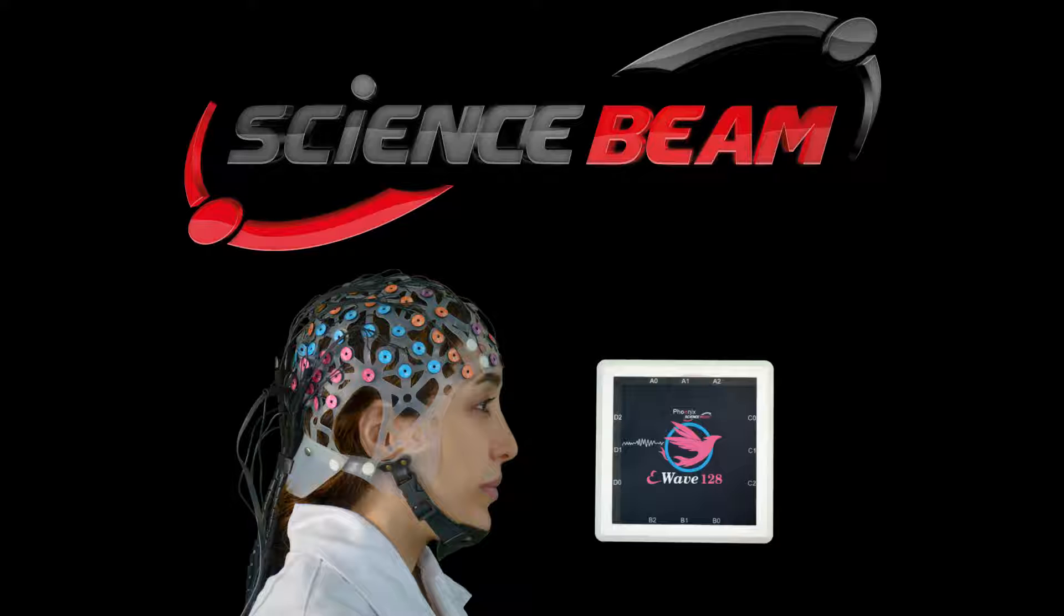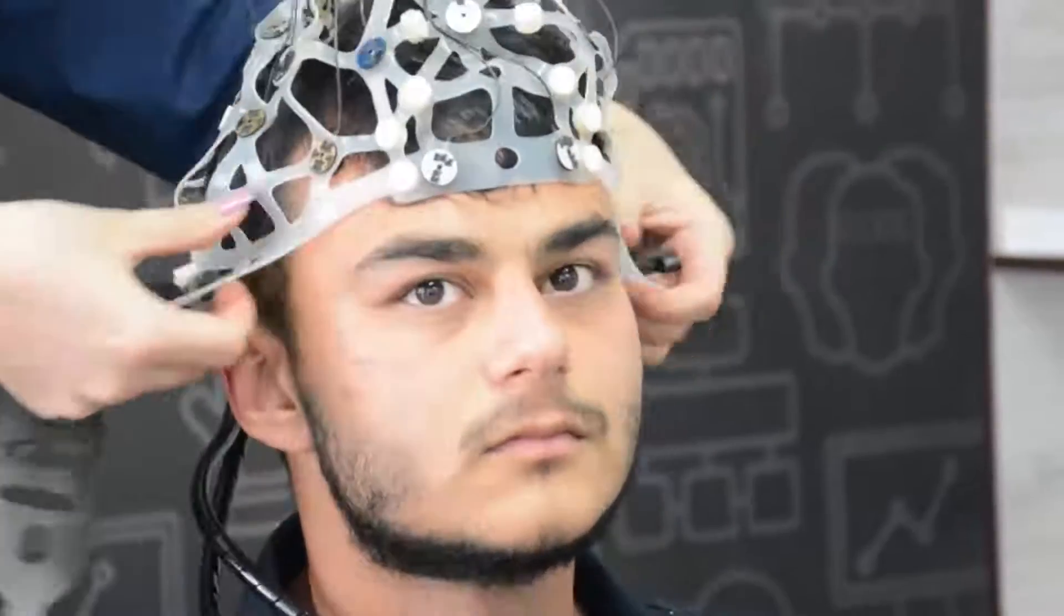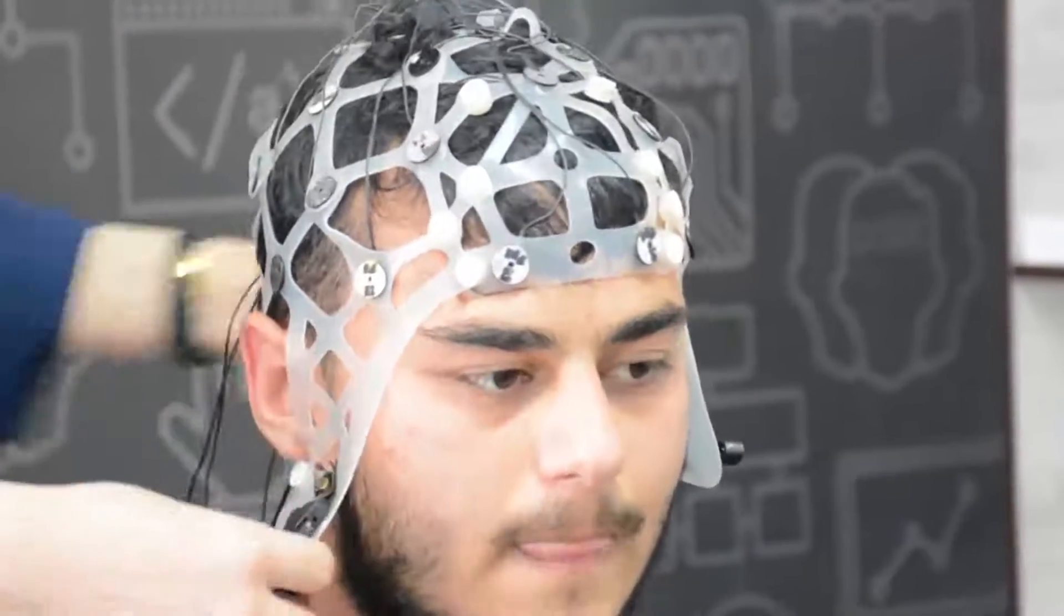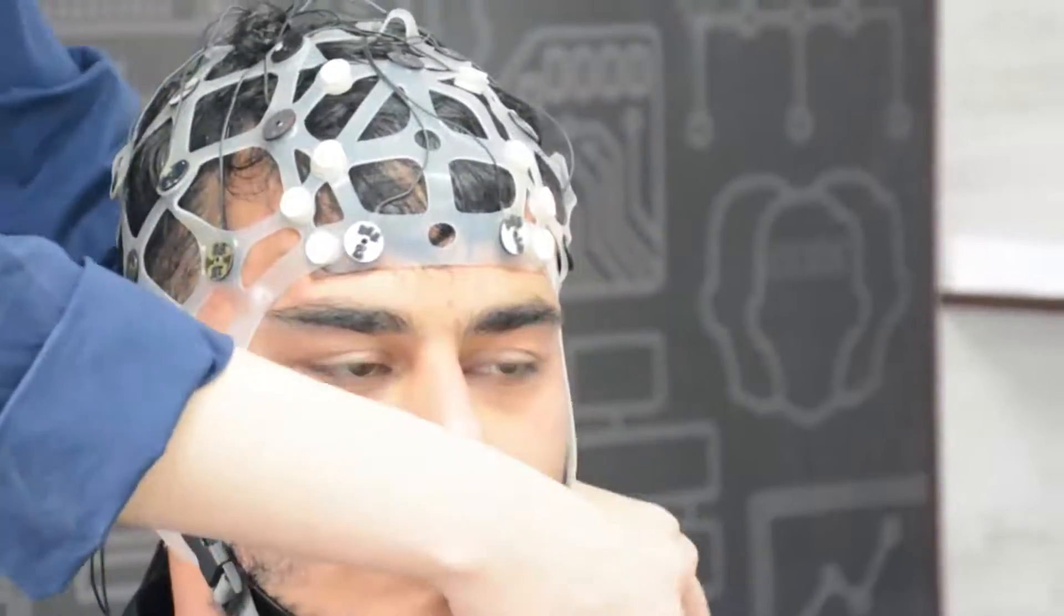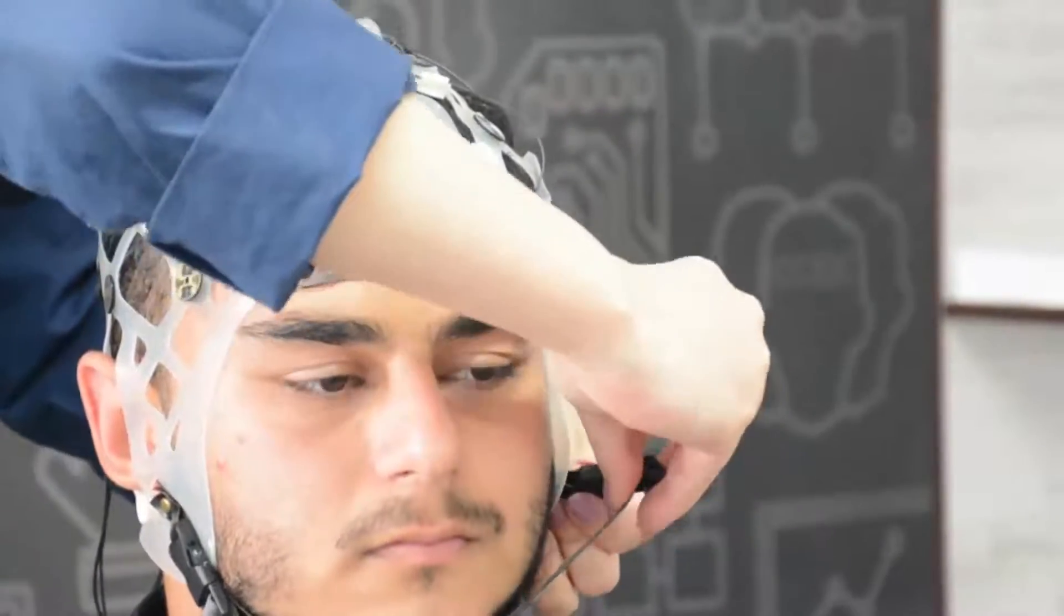To start EEG recording, you need to put the EEG cap on the client's head. This silicone cap is designed by Science Beam for consistent and noise-free signal recording. Please don't forget to use a strap to make it fixed for better recording.